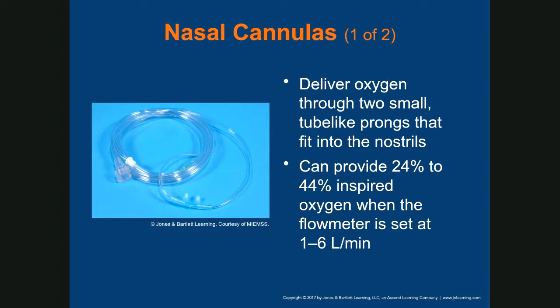Now, if you have to give a patient oxygen therapy over an extended period of time, then you need to use a humidifier, right? It will moisten the oxygen. Once you have to give long-term oxygen therapy, ensure that it is humidified. So again, the textbook answer to the question, 1 to 6 liters per minute, that's a range. As an EMS provider in the field, do not go beyond 3 to 4 liters. If you have to go beyond that, might as well use a high flow device.